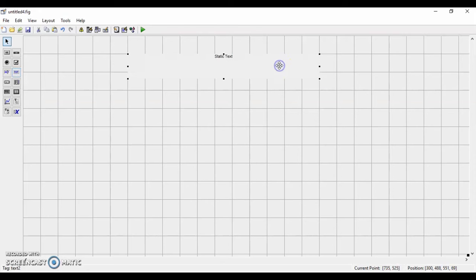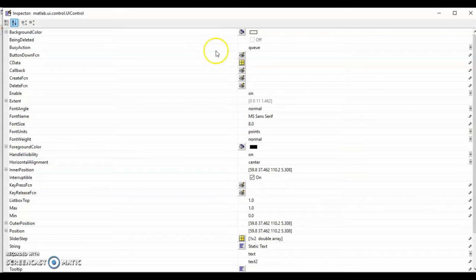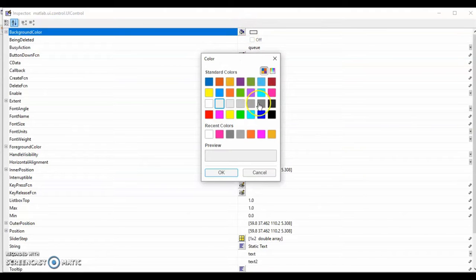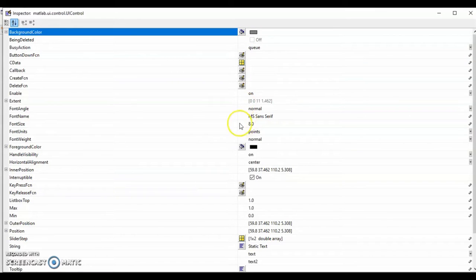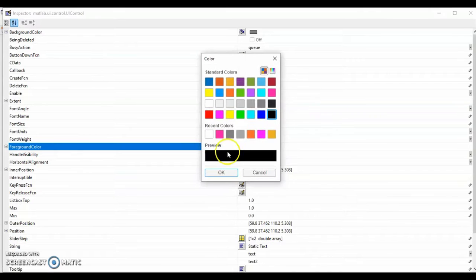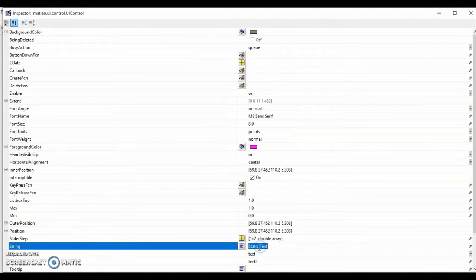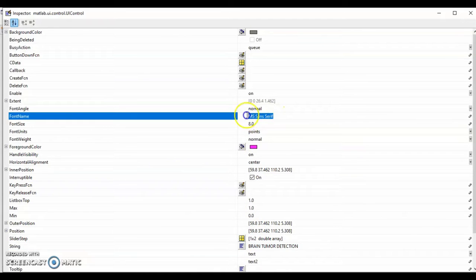Then we can adjust the text box color, font size, style, and color by double clicking the text box. And we will change the background color to gray color. And we will change the foreground color to purple color. And next we will change the title to brain tumor detection. So we will change the font style to classic robot and the font size to 40.